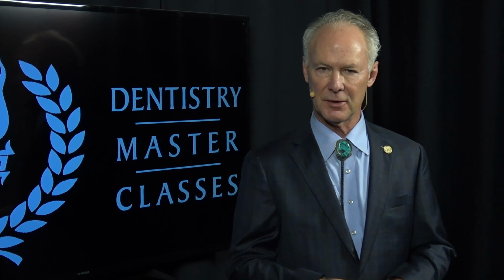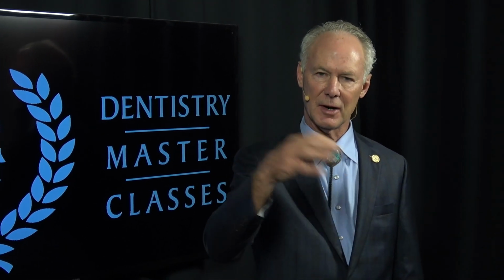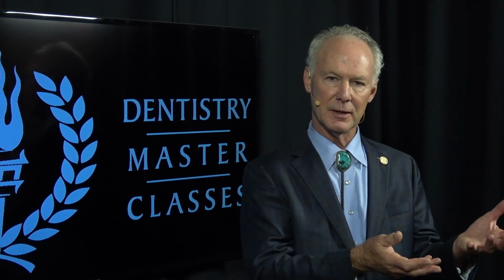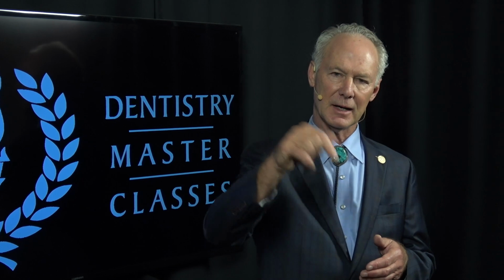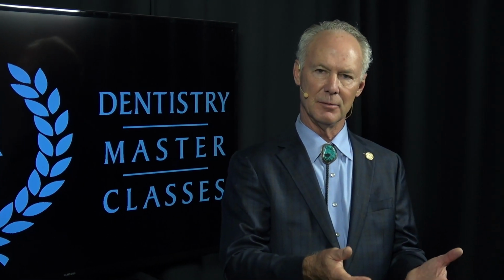Now, if it's a molar tooth, those are multi-rooted teeth, I personally don't place the implant at the time of tooth extraction. If it's a molar tooth, I extract the tooth and graft the socket with artificial bone or platelet-rich fibrin or a combination of both of them, and let that heal for at least 3 months. Then come back and place the implant, let that osseointegrate for 3 months, then take an impression, send it to the lab, and place the abutment and crown.